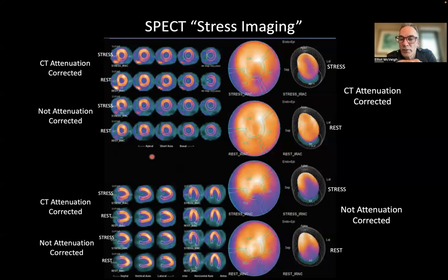Now, for attenuation, all we're talking about here in SPECT is attenuation. There is no beam hardening in a sense because our beam is absolutely monoenergetic. We start with a 140 keV photon, and that's what we've got to work with. It can lose energy in collisions, so there's beam softening, but it's not really a beam, it just loses intensity.